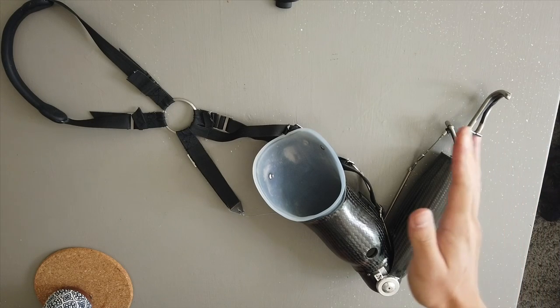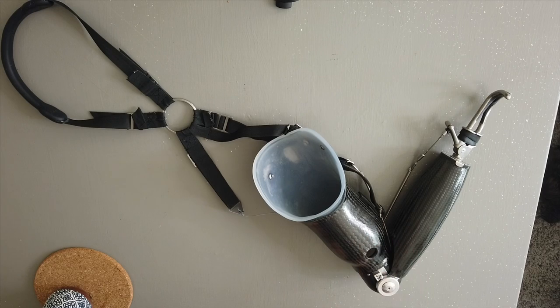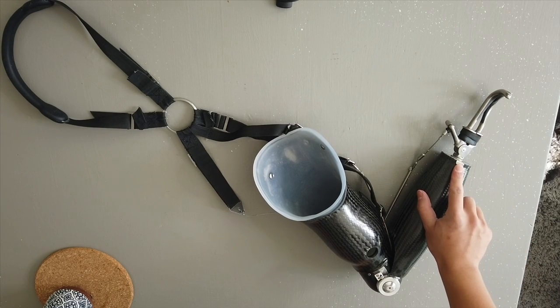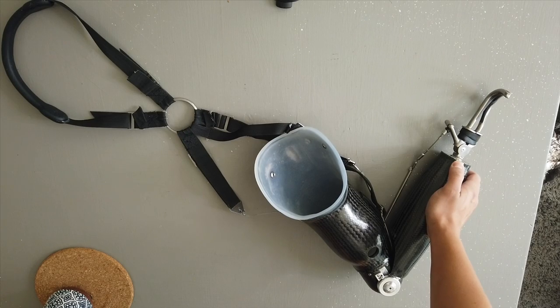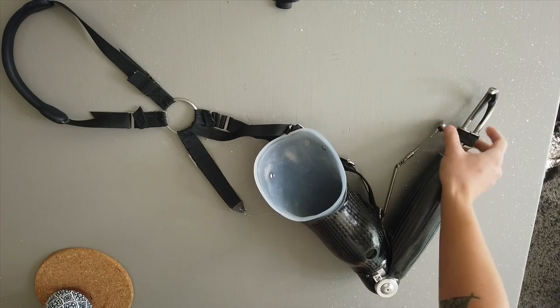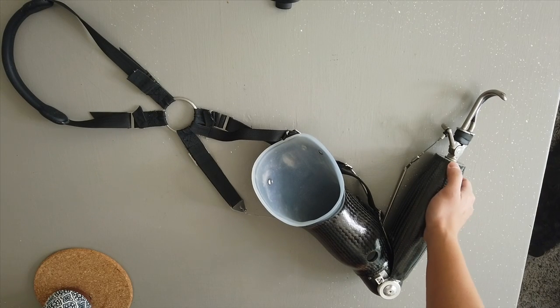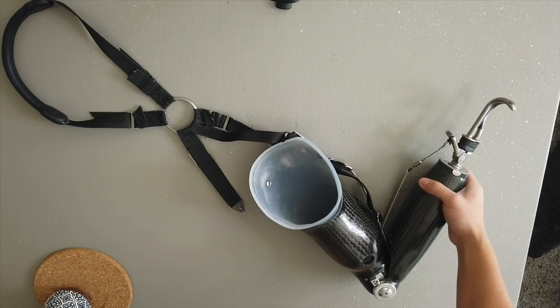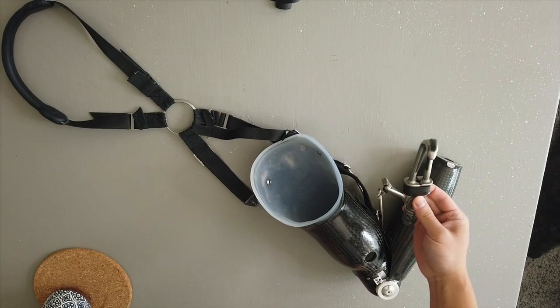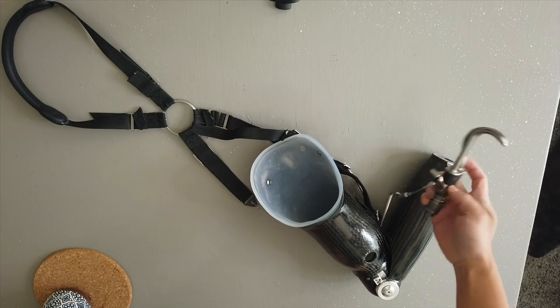I'll just kind of walk through each part from right to left. Prosthetic hook — here you have a button. If you press on it lightly, you can rotate the prosthetic hook. If you press this button harder, they have different attachments that are manufactured and designed for different tasks.